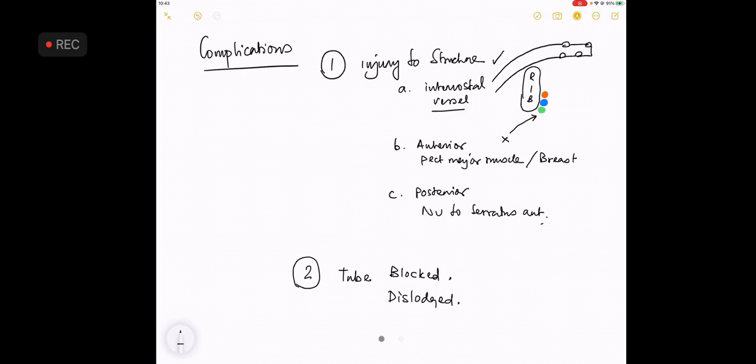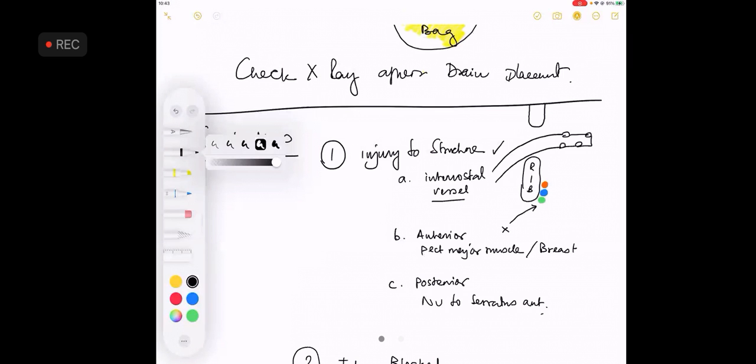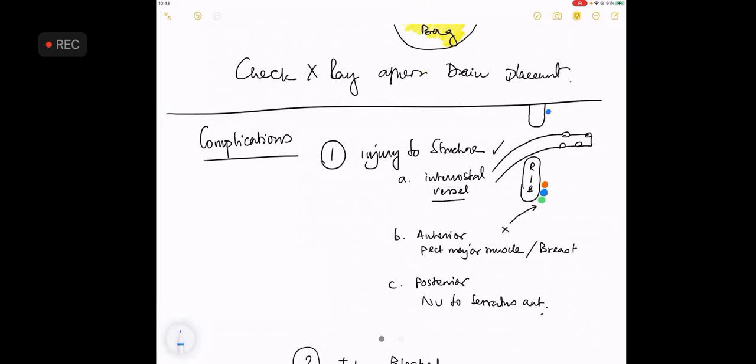We come to the last point of an ICD placement. Sir, I placed it above this rib, but the vessels are below the rib above it. Sir, very good question. That means that you are on this point now. Hence, there is that upper rib vessel. That's a very good question. Upper rib vessels are always along the lower border.